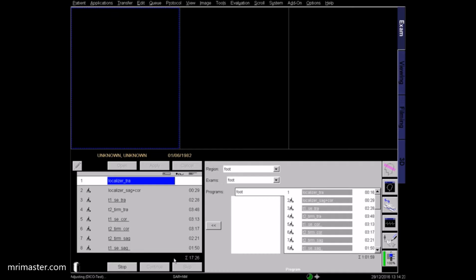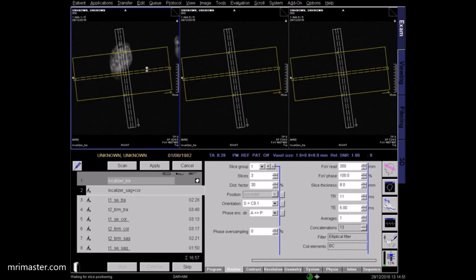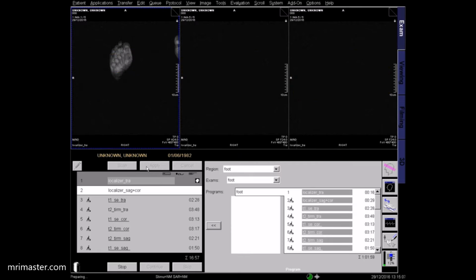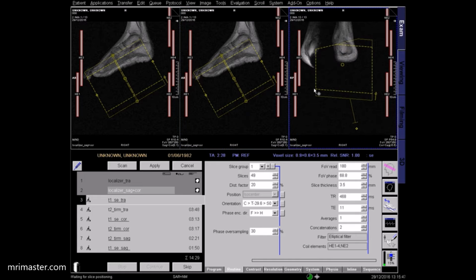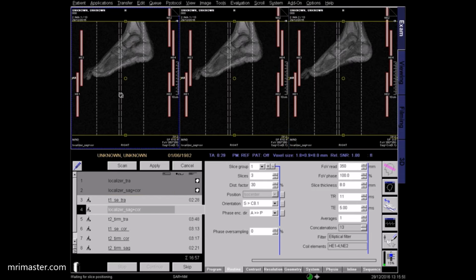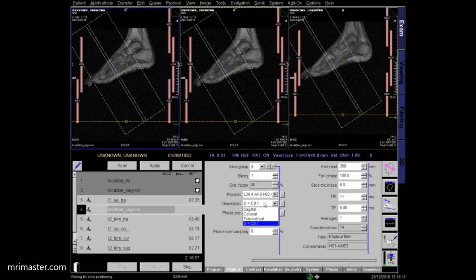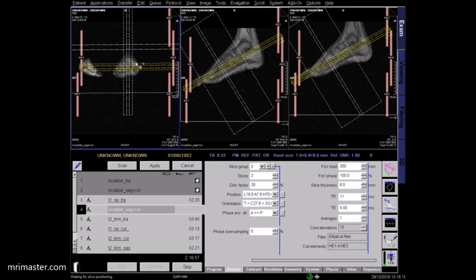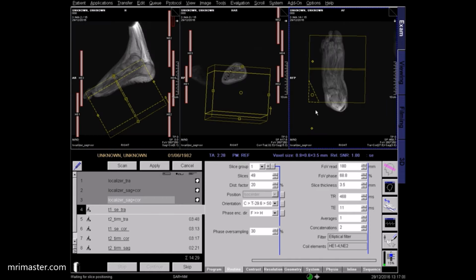Begin the scan with an axial localizer sequence. It's important to obtain good localizers in all three planes. This is to ensure adequate images for the planning of the next sequences. If necessary, repeat the localizer. In our protocol, we acquire T1 and STIR imaging in all three planes. The first sequence in this protocol is a T1 axial.